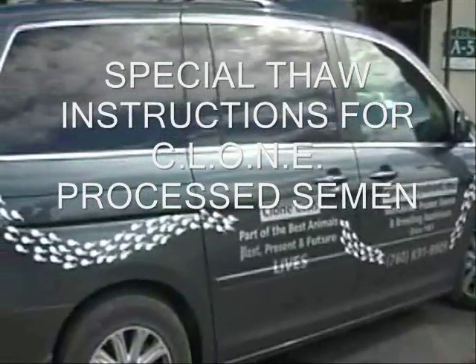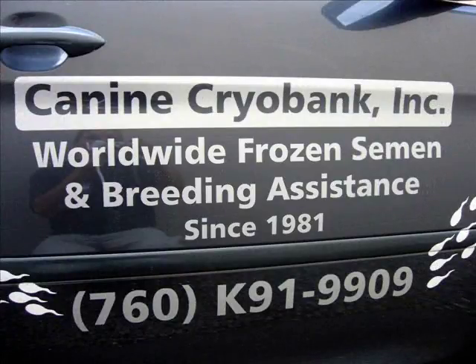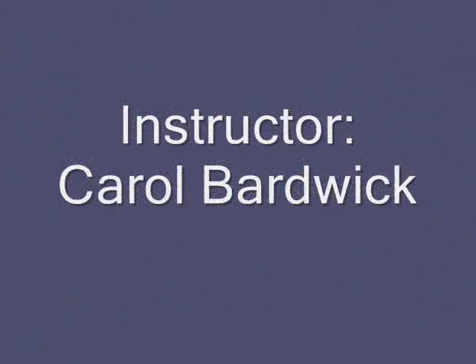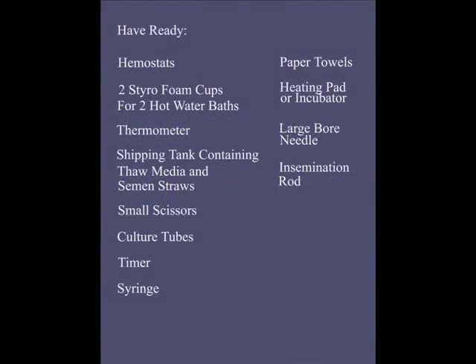Special thaw instructions for clone processed semen, as used by the Canine Cryobank. Have ready hemostats, 2 styrofoam cups for 2 hot water baths, thermometer, shipping tank containing thaw media and semen straws, small scissors, culture tubes, timer, syringe, paper towels, heating pad or incubator, large bore needle, and insemination rod.